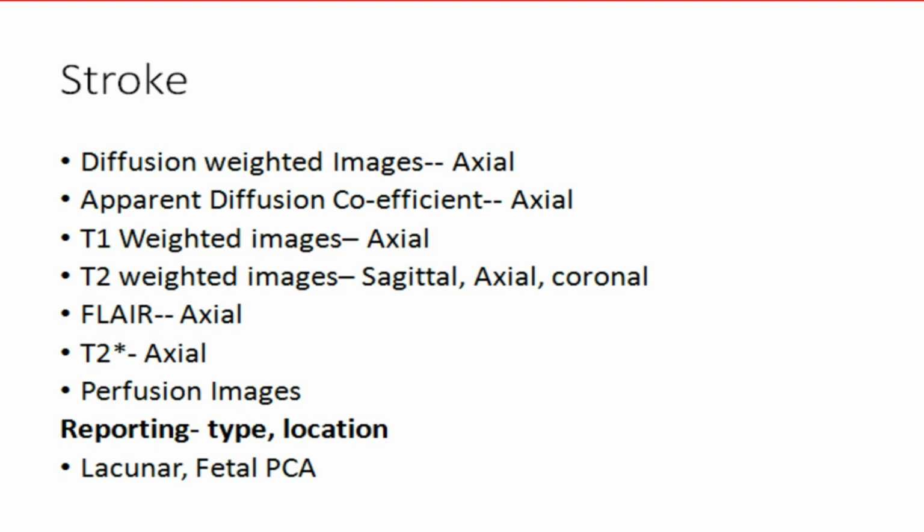You cannot say it's a stroke. It's just a hypo-intensity. It could be stroke based on the history, but it doesn't clarify the question. And how old was the stroke?